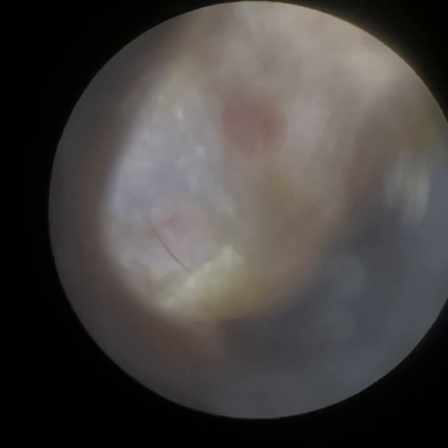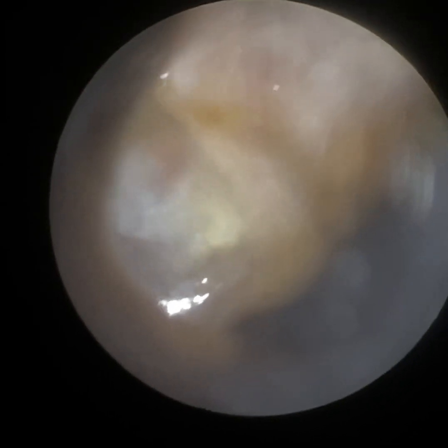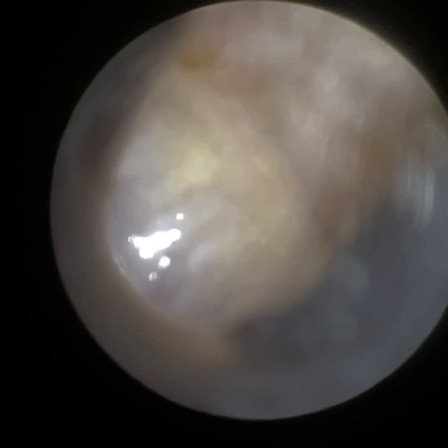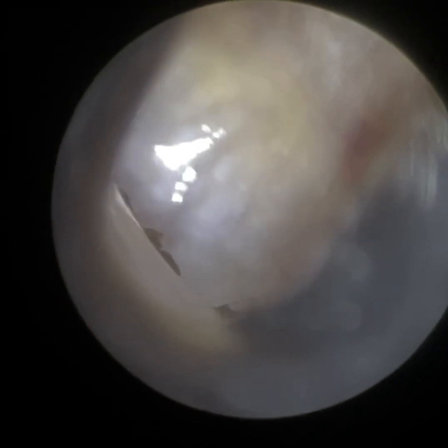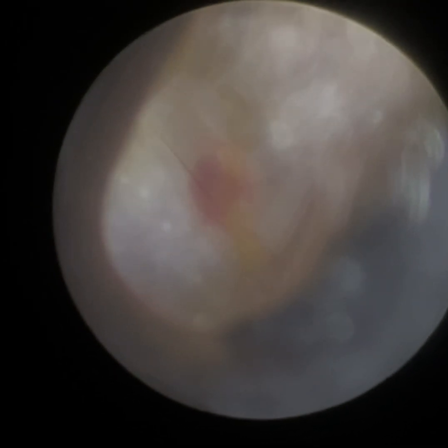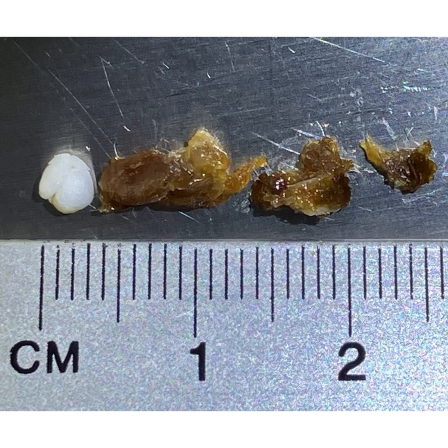So I'm just going to go back in. You can see that's that bruise at the back of the eardrum. Otherwise I think it looks quite well and healthy. Patient can hear significantly better. They did marvelously well being so still, given their age. And in a moment you're going to see a still image of not only the wax, but the polystyrene foam piece that had become lodged in the patient's right ear.